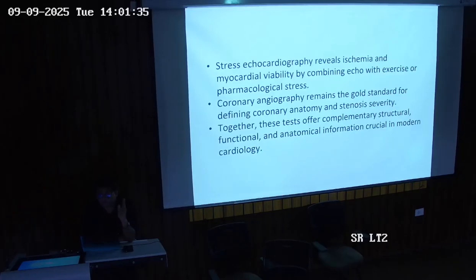Suppose a patient comes to you after 14 days or 1 week or 1 month, the patient has ischemic pain and echo is suggestive of necrosis. So we have to diagnose whether the viability of the myocardium persists or not. If viability of the surrounding myocardium is there, then we can go for PTCA or CABG. To reveal this ischemia and myocardial viability, we have to do echo along with exercise and pharmacological intervention, that is known as stress echo.